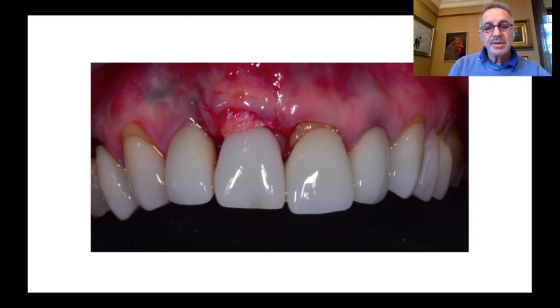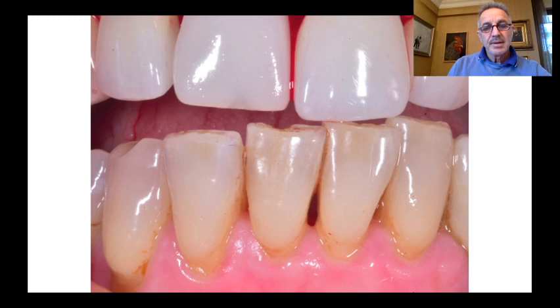And this is the situation just before the patient leaves the office. Check your occlusion carefully. You have to make sure that during chewing movement or protrusive movement, it is out of contact with the lower jaw.